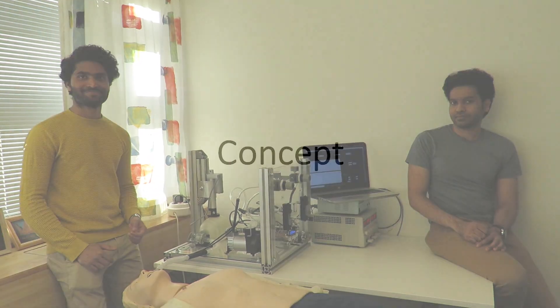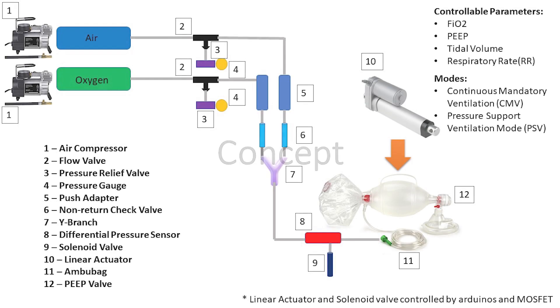Let's dive in to see how the ventilator works. Most open-source ventilator designs around the world don't include an air-oxygen mixing part to set the required fraction of inspiratory oxygen, medically termed as FiO2. But in our design, we have included flow valves for controlling the air and oxygen supplies.